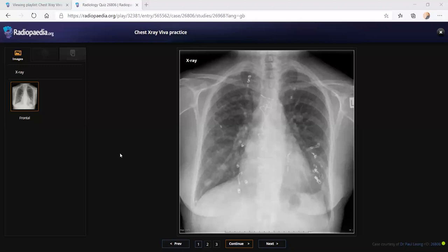Patient is not a known case of malignancy. If it is not a known case of malignancy, even then, first I would like to compare with the previous film and see if these opacities were there. Unfortunately, the previous films were not available. So in that case, I would like to basically rule out any sinister findings, and still would like to go for cross-sectional imaging to take it further.